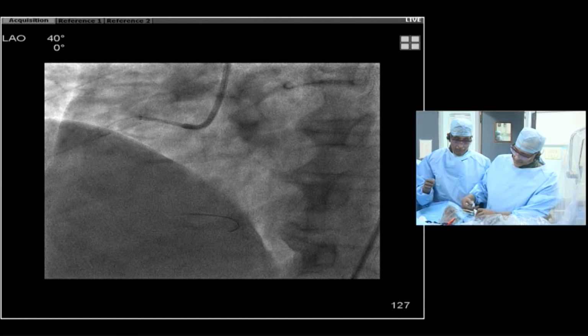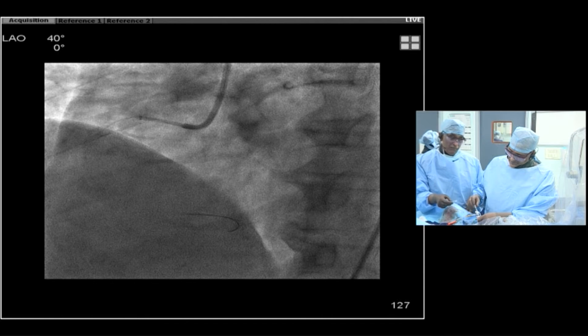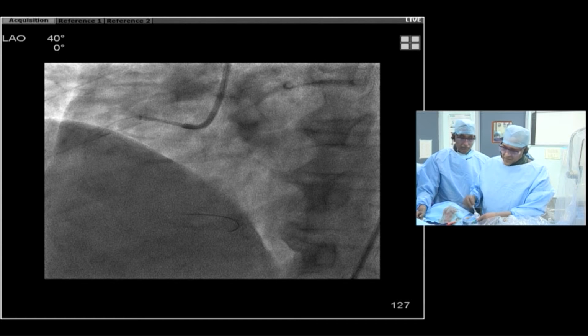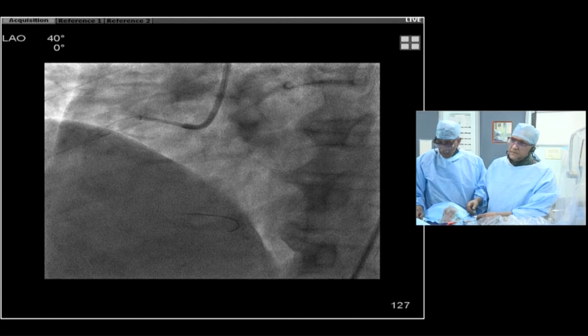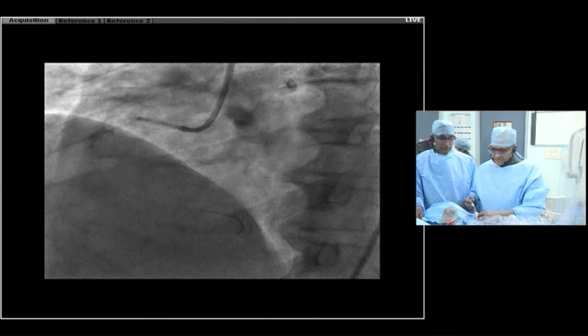Would you then try to go through with a laser, also in a very, very calcified CTO? Yeah, in my practice, that's what I would do next. And if that fails, sometimes it's going to fail, then you start doing things like going subintimal or external cap crush or other things like that. But there's no downside to trying it there.